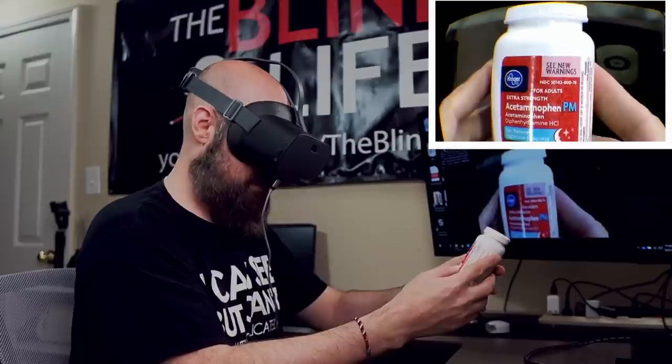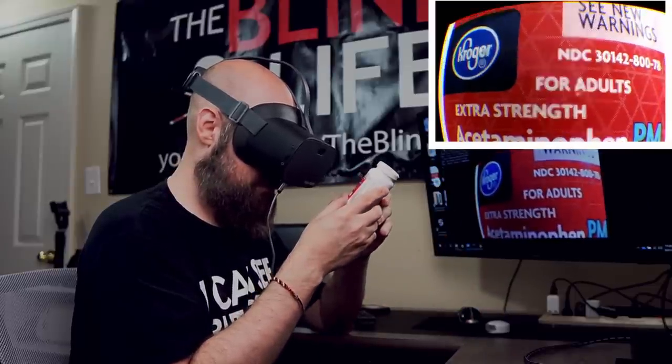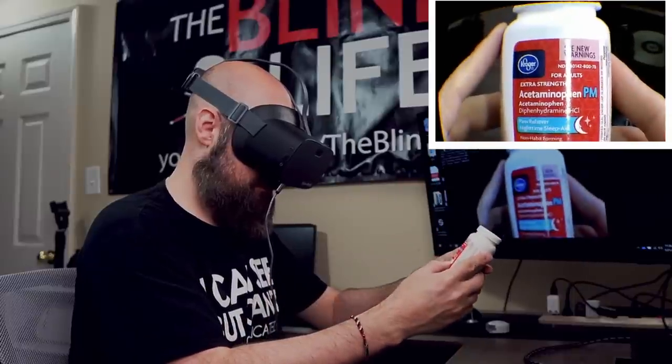Autofocus works pretty well. If I hold it out far away and then bring it closer, the autofocus is pretty snappy.